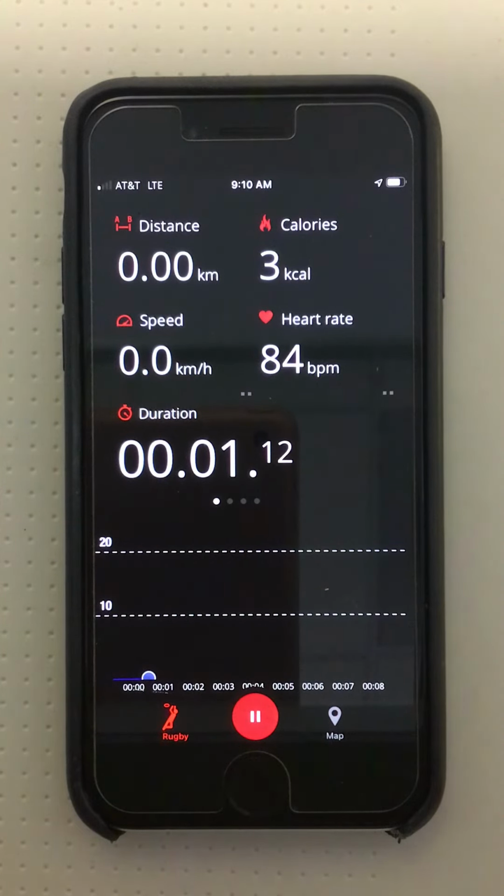At 90% heart rate max, the text will transition to red, which actually exceeds the high intensity training zone. Utilizing the color scheme that the Polar app has set up allows me to quickly understand where my patient is at without having to memorize or reference the patient-specific training zones mid-session.